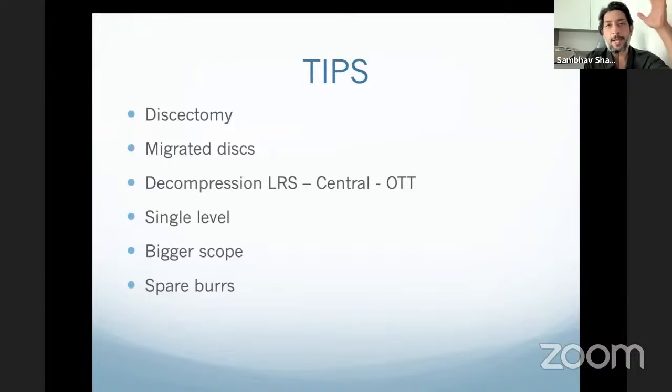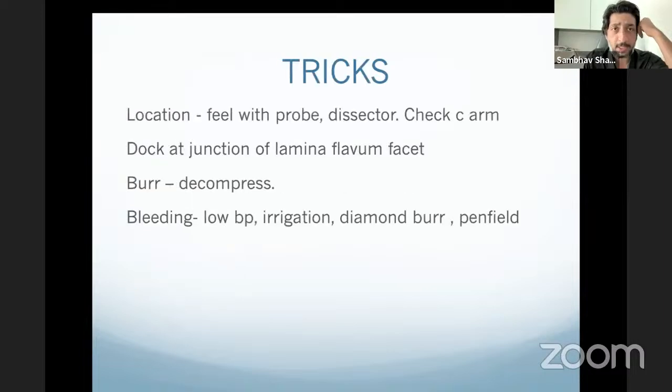And always keep spare burrs. Don't start with just one burr. Initially, when I started, I think all of us can vouch, from Dr. Lokhande to Ayush, that we all have broken burrs initially. It is a part of the learning curve. So don't just start with having one burr inside your OT, because you are going to break burrs initially in the start of your decompression career. Locate yourself very well. Be sure where you are. Feel with the probe.